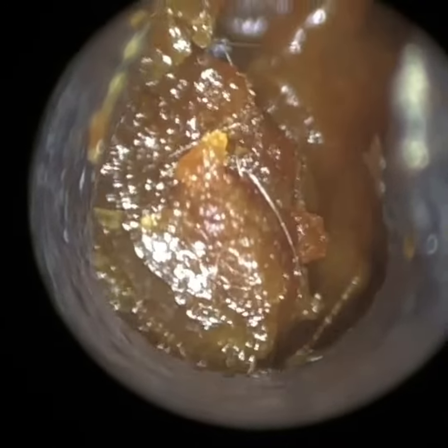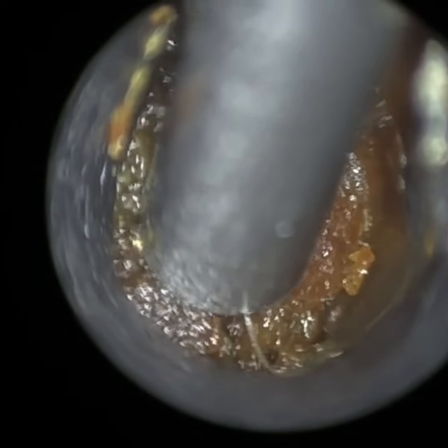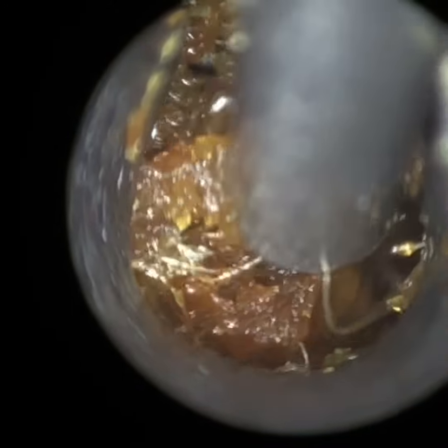I'm just going to tease that out. The main occlusion is removed — it's just some wax and keratin at the base and on the posterior canal wall. It's just hovering over here; we don't want to make contact with the patient's ear canal. I'm just letting the suction do the work, trying to lift this up and away. You can see all those skin adhesions that are holding on to the wax — as you lift it up and away, you detach it from the skin, which mobilises the wax and we can safely remove it. There is a bit of wax just a bit further in, deeper in the ear.